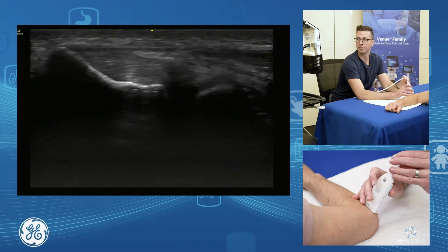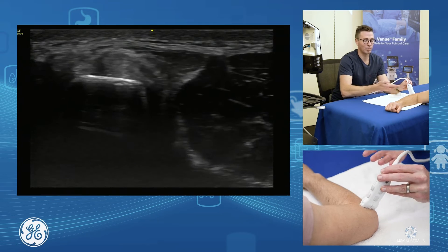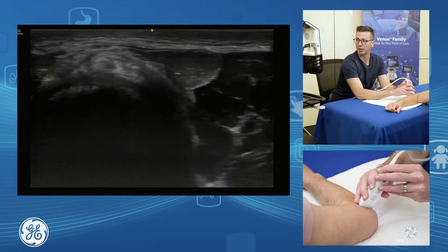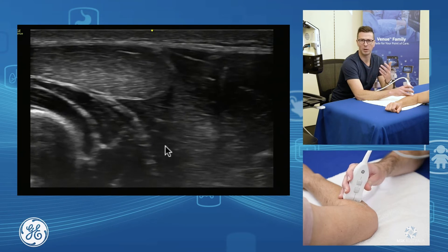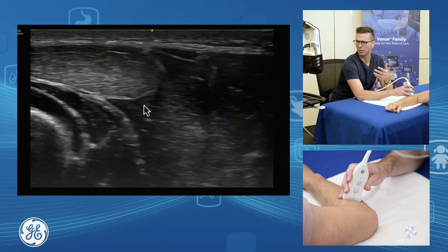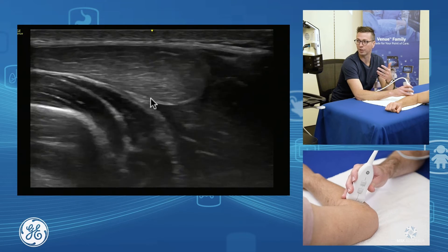You can assess it in long axis and also in short axis. If I bring my probe down towards the patient's hand, I can see the muscle — primarily our extensor carpi radialis brevis, with our extensor digitorum communis sitting on top and our supinator underneath.